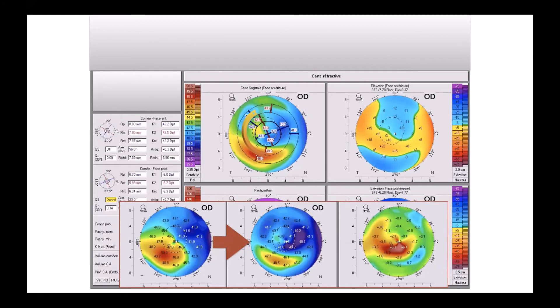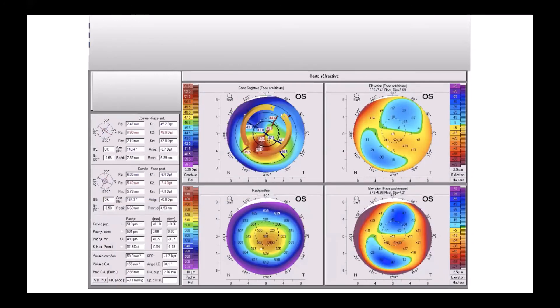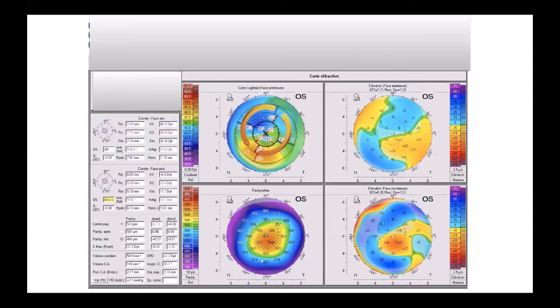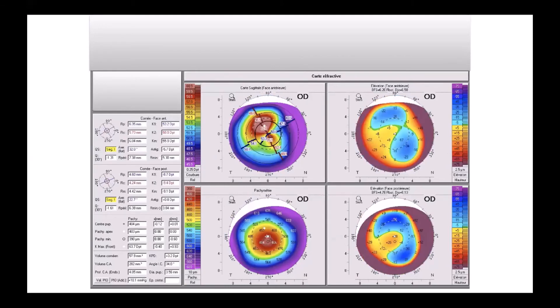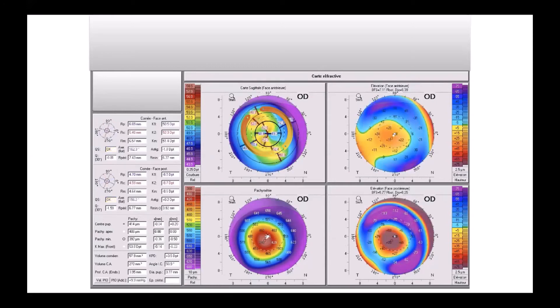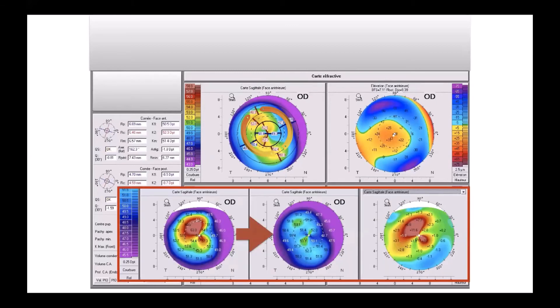The differential map looks like a duck. We can conclude that the effect of this kind of asymmetric intracorneal ring performs an asymmetric flattening. Here is the snowman and asymmetric rings — an inverted snowman. We can use the asymmetric ring segment symmetrically too. The result was very good and the differential map is very clear with almost 11.6 diopters of difference.